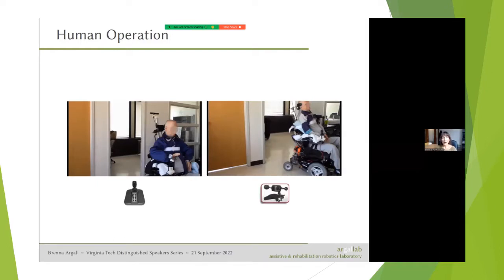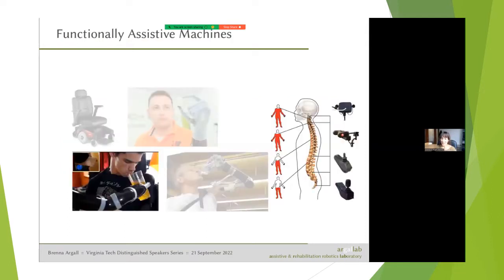I think that doorways that meet ADA width clearance have only about 10 centimeters of clearance in addition to the wheelchair. So it's not a lot of space. And there are a lot of spatially constrained tasks like this that wheelchair operators need to navigate all the time. As we consider using these interfaces to control more complex machines, so higher dimensional control than just two dimensions, this becomes all the more challenging. So in this lower image, we see the Kinova Jaco arm.